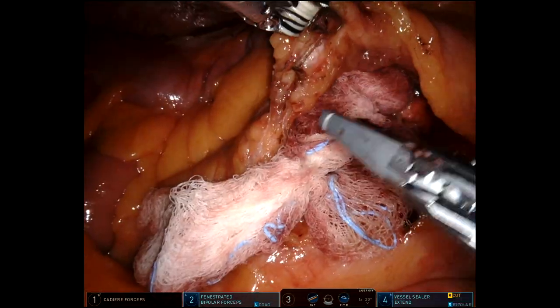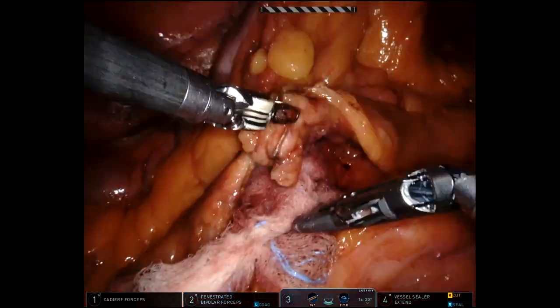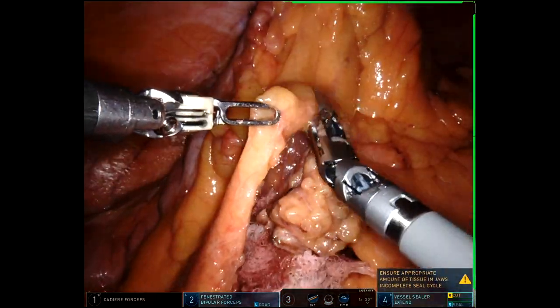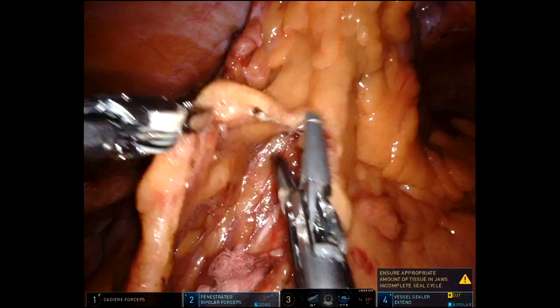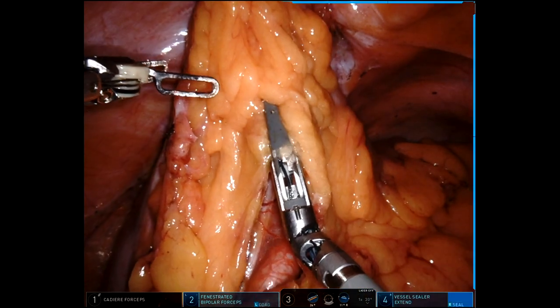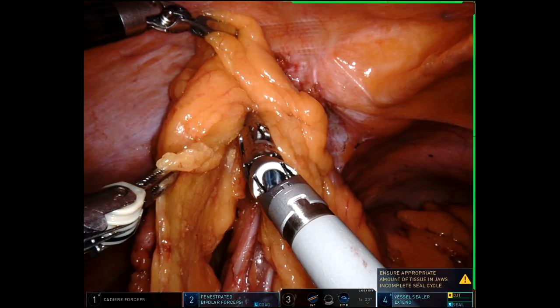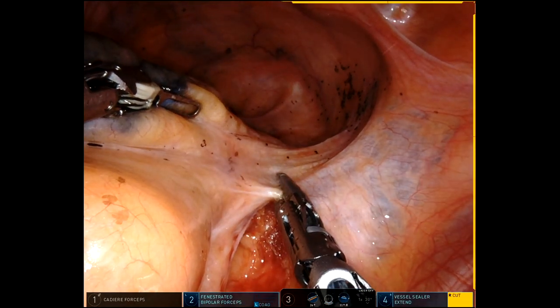So I'm going to go ahead and take my mesentery to the proximal margin. I did not take the IMV in this case for length purposes — I felt like I had really nice mesenteric clearance and didn't need the extra lymph node tissue just to get the length, so I left the IMV. This patient did have 36 nodes in their specimen, two of them were positive. After I take the proximal margin, I'll go ahead and take the distal margin.